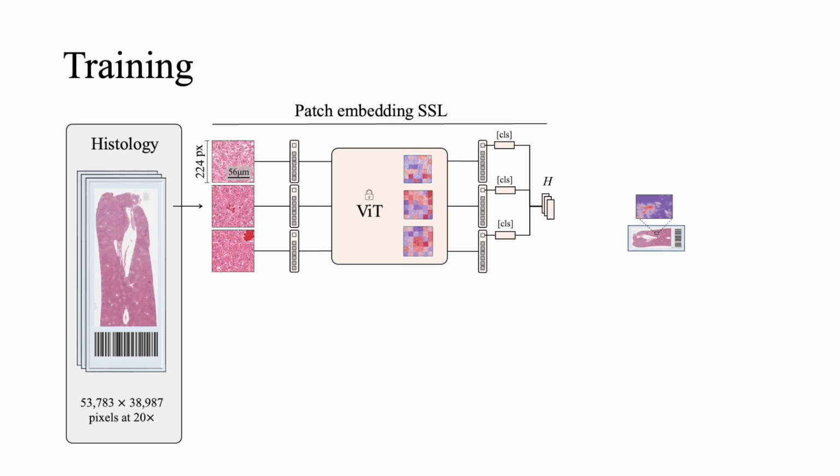So what we want to do in the next step is to assign weights or importance to the patches. That we do with an ABMIL structure, which is basically a weighted summarization of the pooled patch embeddings. During the training process, the model learns to assign the importance of the patches.